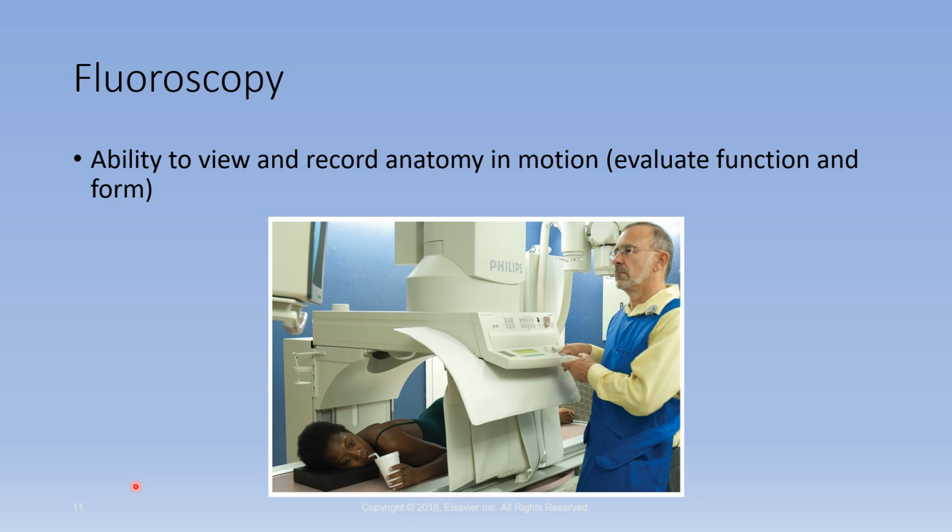And when we talk about fluoroscopy, we've mentioned before that fluoroscopy is actually radiography in motion. It's dynamic imaging, meaning that we have the ability to look at anatomy and record it in motion.